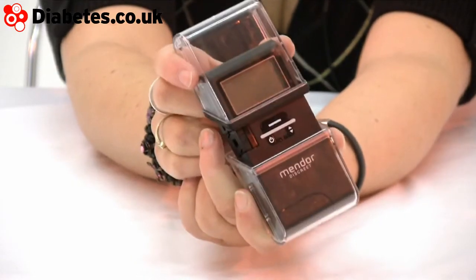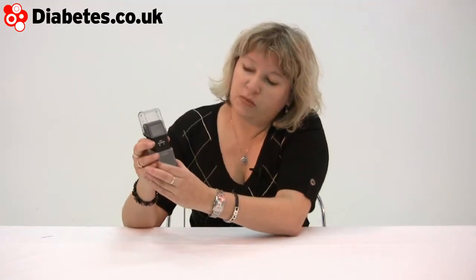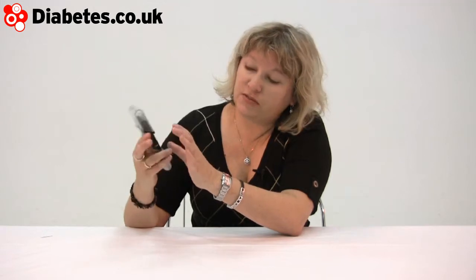So there's two sliding parts up and down. With the down part there are two movements — when you come down once, it pulls out the strip, and then the second time it primes the lancing device.